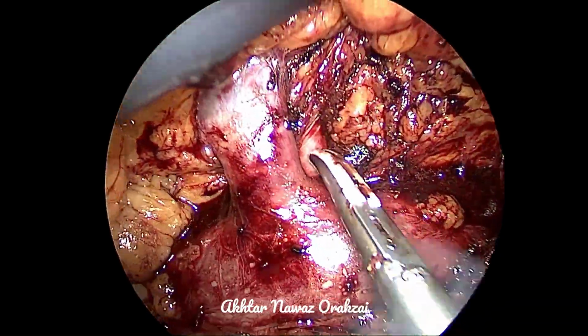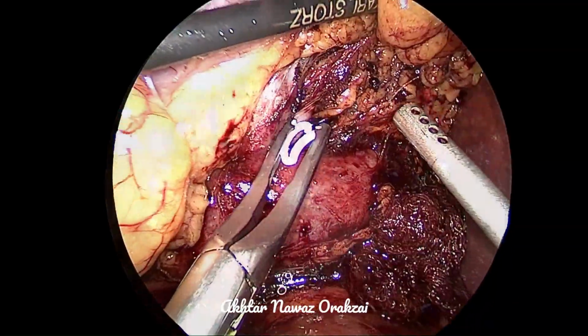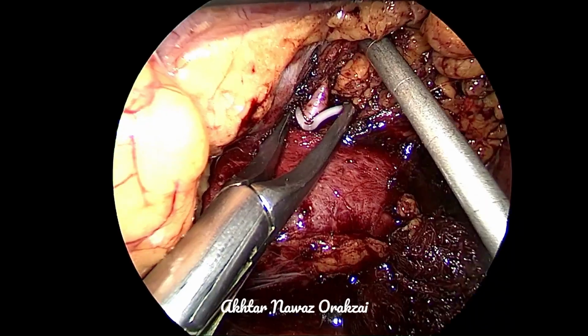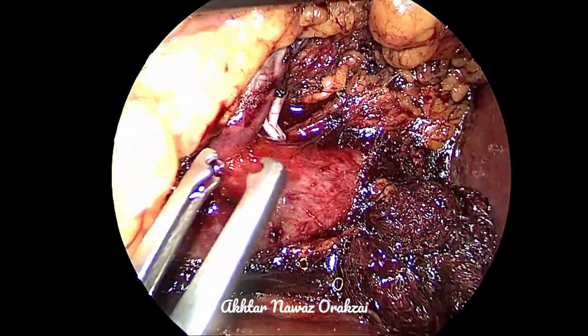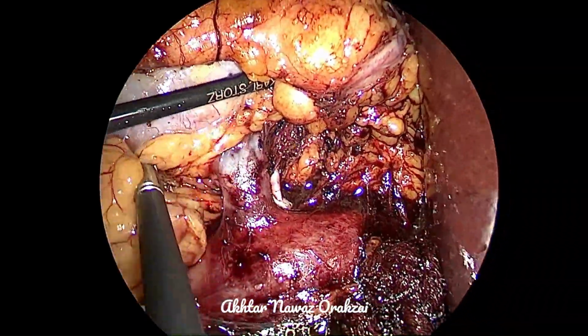So dissection of the artery is completed nicely. It's a big artery, so once we are able to clip it, the vein is going to be collapsing, as expected. You can see that the pressure in the vein is minimal now.